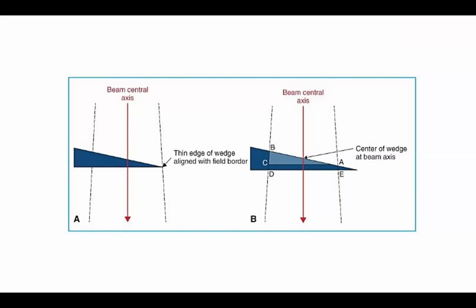Okay, sir. You know anything about other wedges like the universal wedge? Universal wedge, sir. We will use that 60 degrees wedge as the universal wedge, sir, by moving the 60 degrees.